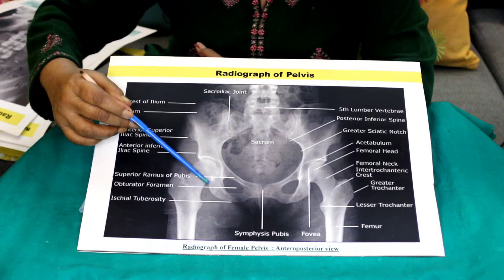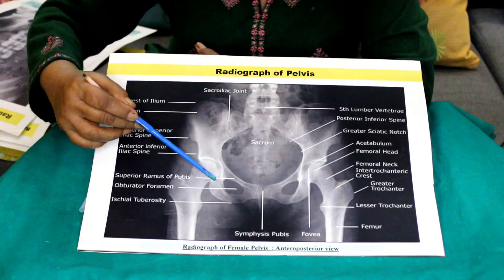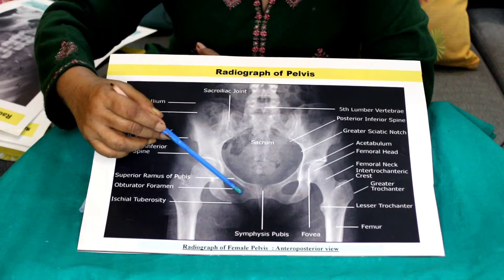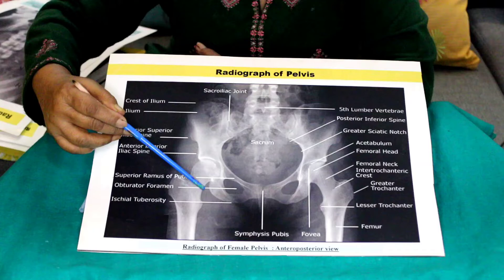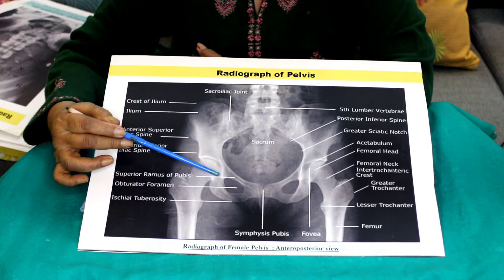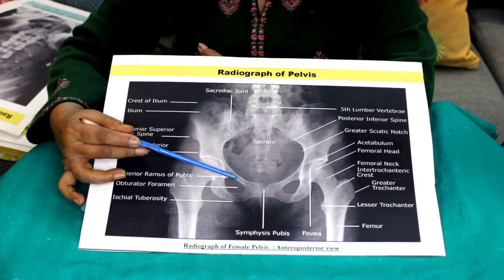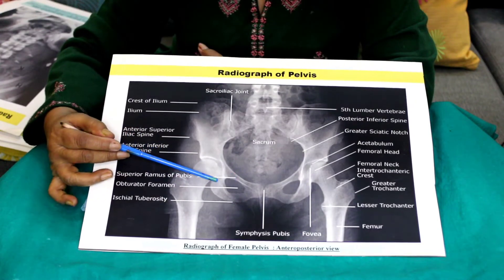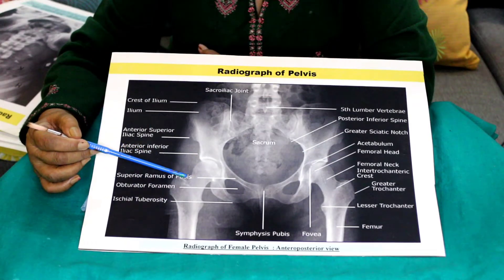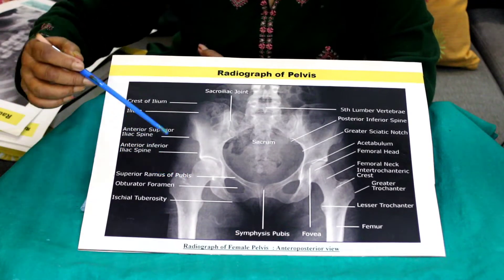The lower border of the neck forms an oblique arcuate curved line with the obturator foramen of the hip bone. This is the obturator foramen, and this line is known as Shenton's line. Shenton's line is important because in a fracture of the neck of the femur, this line is not smooth — there will be distortion of Shenton's line.